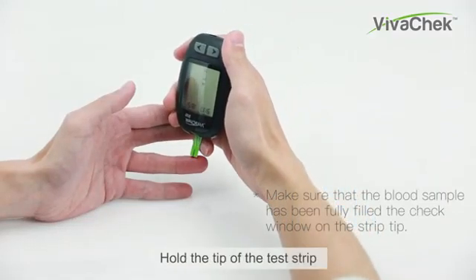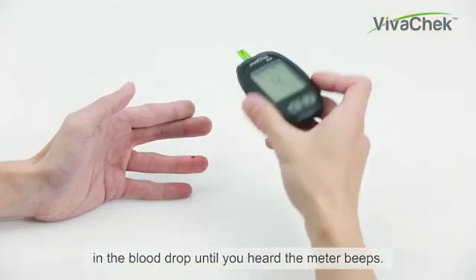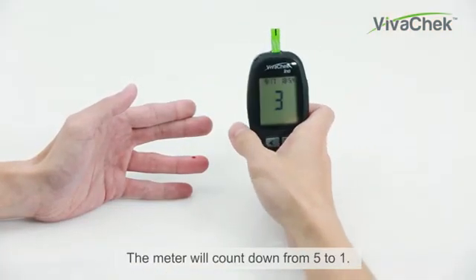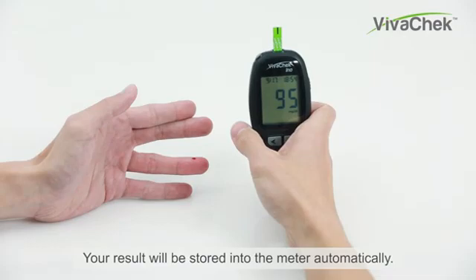Immediately touch the tip of the test strip to the drop of blood. Hold the tip of the test strip in the blood drop until you hear the meter beep. The meter will count down from 5 to 1. When you have your test result on screen, your result will be stored into the meter automatically.